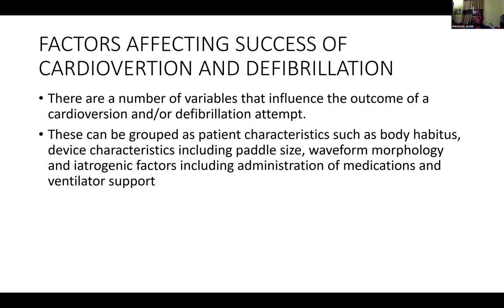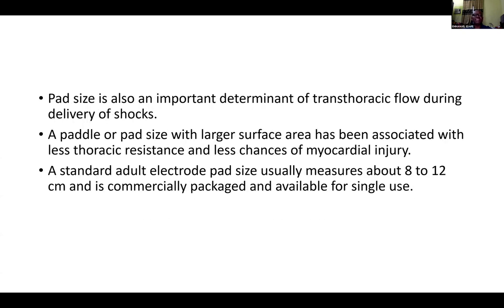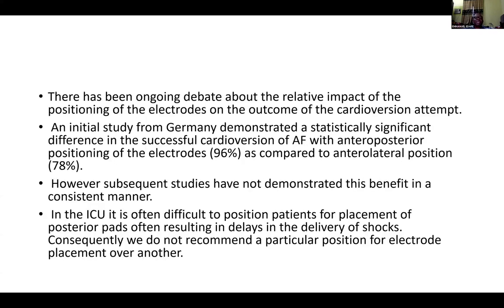Once that is done, the patient is cardioverted or defibrillated and returns to sinus rhythm. Once the sinus rhythm is restored, you place the patient in the recovery position, keep watching the patient and ensure that the patient doesn't go back. Continue the patient on medication and ensure that the patient doesn't return to the arrhythmia.